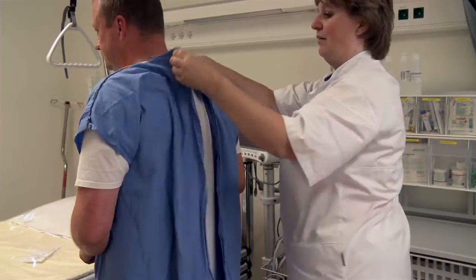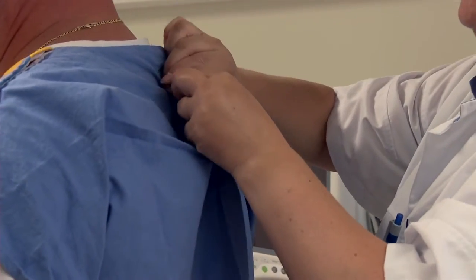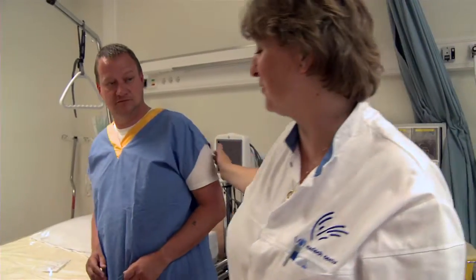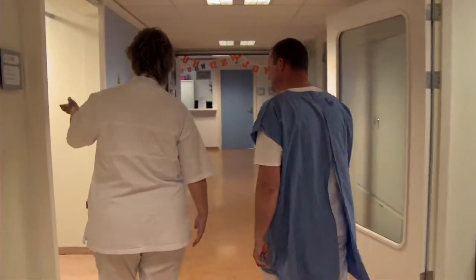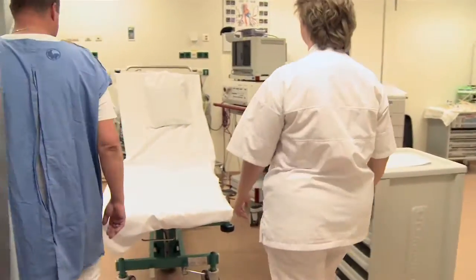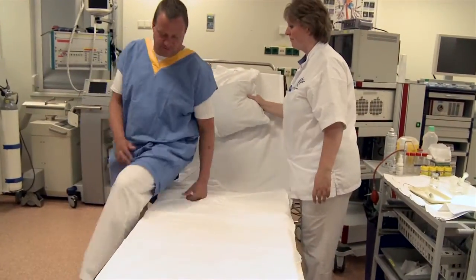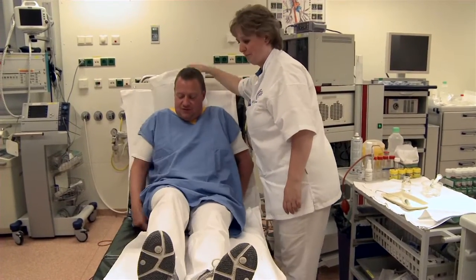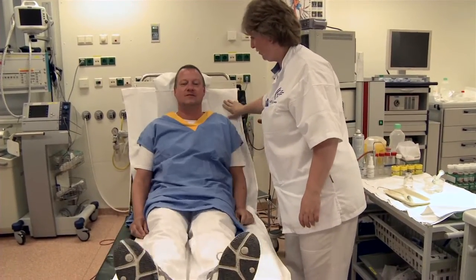Because patients are often anxious about a bronchoscopy, it is important to make the patient feel at ease. This can be achieved by a few simple measures. First, it is important that the room is quiet when the patient enters. Second, the patient should be seated comfortably. And most importantly, the nurse should be well prepared and have all the necessary medication and equipment within reach.